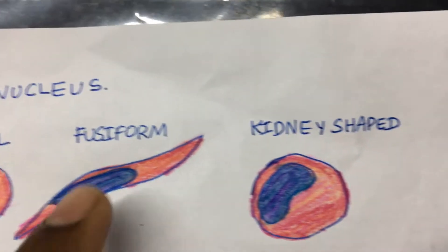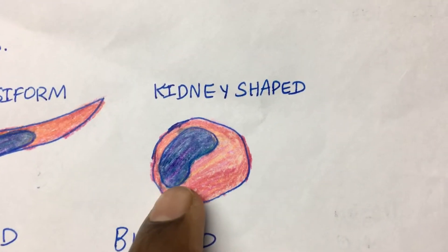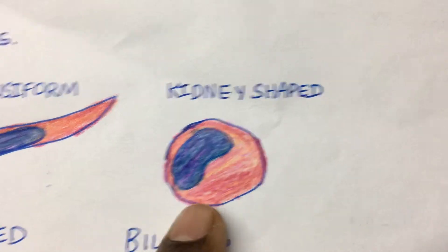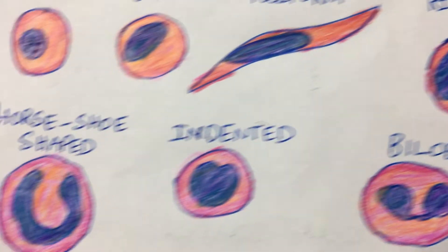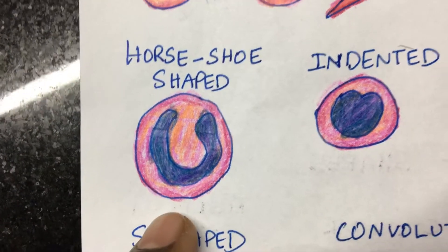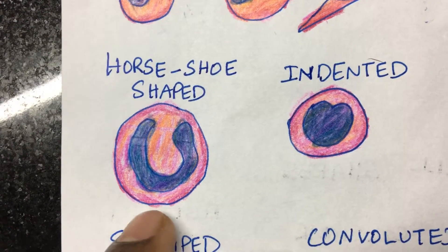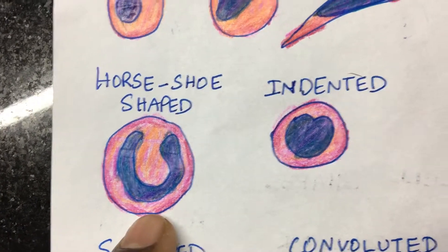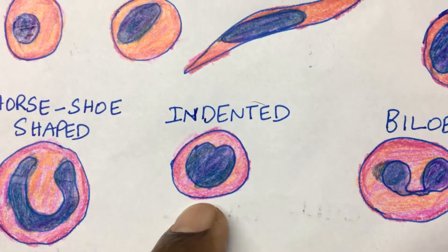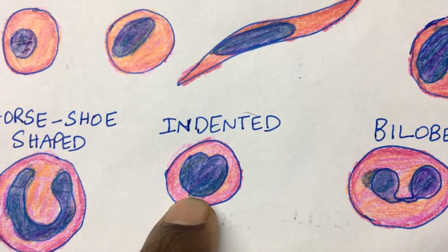Then you have the kidney-shaped nucleus, which is very commonly seen in macrophages and monocytes. And you have the horseshoe-shaped nucleus, which is commonly seen in band neutrophils. Here is the mildly indented nucleus, which can sometimes occur in lymphocytes as well.